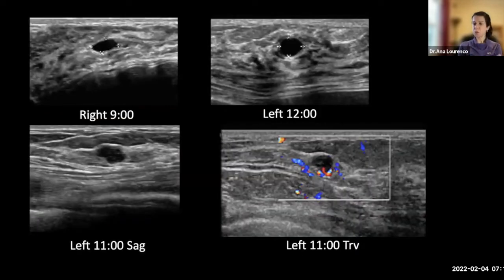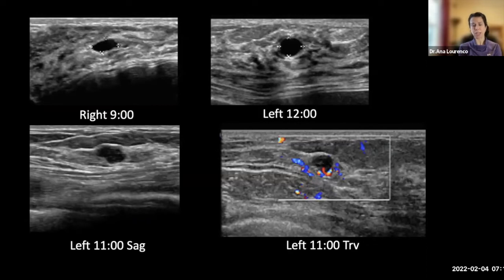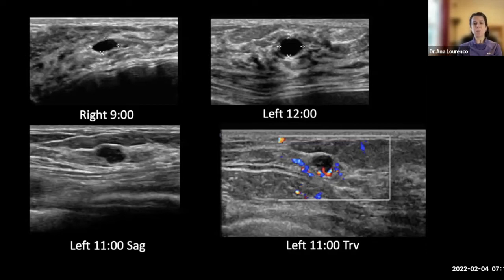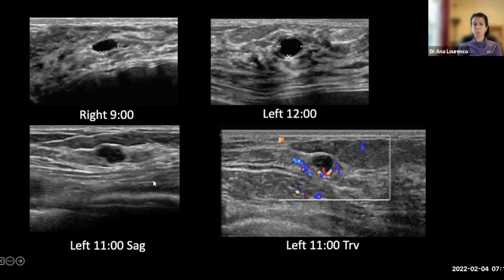This patient had a prior negative mammogram within the last few months. While reviewing the screening ultrasound, I noticed what looked like bilateral scattered cysts — and was getting into a BIRADS II mindset — but then I paused at this one mass with internal echoes, some indistinct margins, and adjacent vascularity. When I went in the room and scanned it, it really didn't look like the adjacent innocent benign cysts, so we recommended it for biopsy.